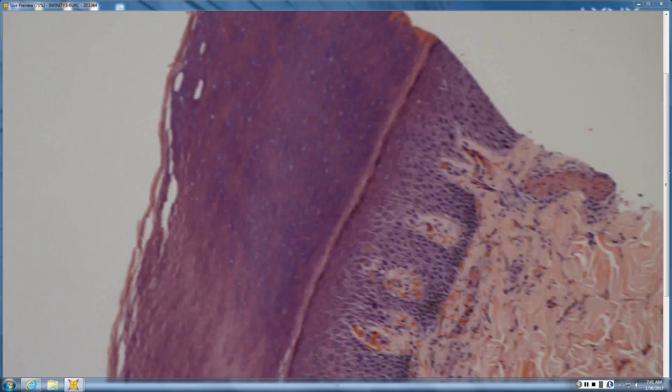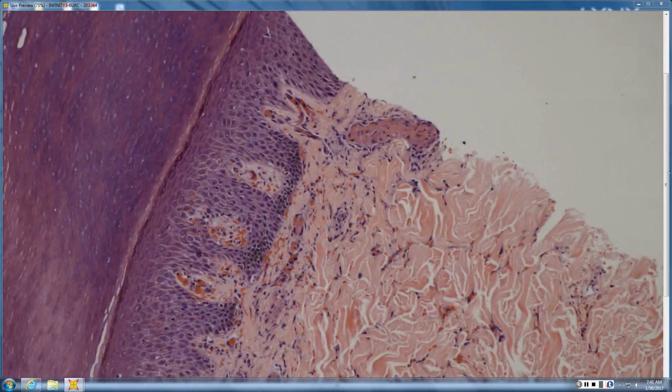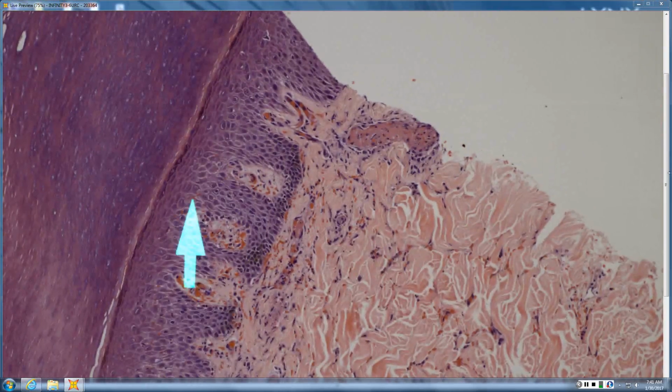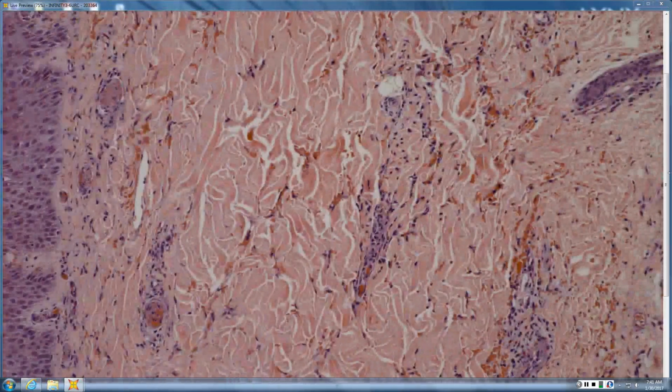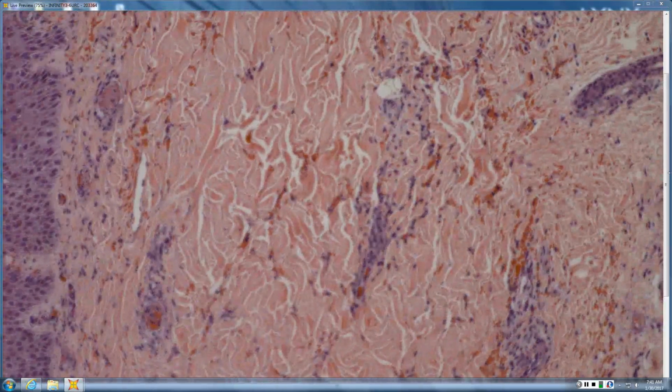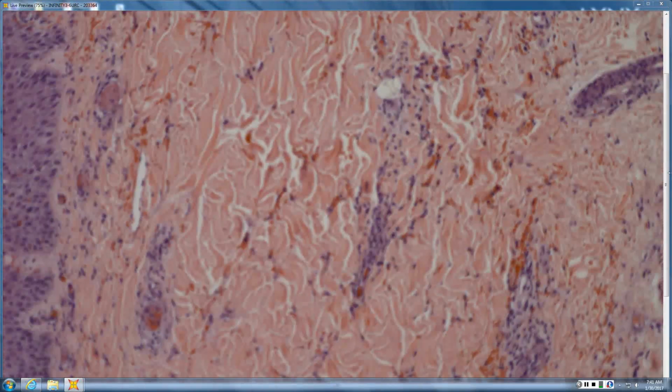and there are collections of neutrophils, and I'll tell the clinicians in the room that in some areas you had hemorrhagic macules on the palm, and in others you had hemorrhagic pustules on the palm. Any kind of sepsis, characteristically with hemorrhagic pustules, think gonococcemia.